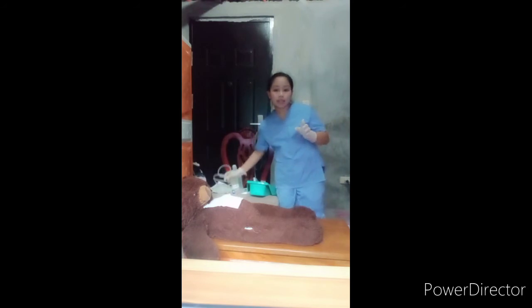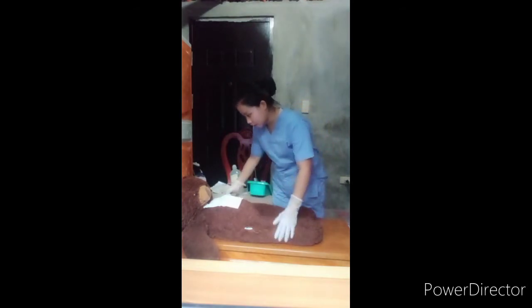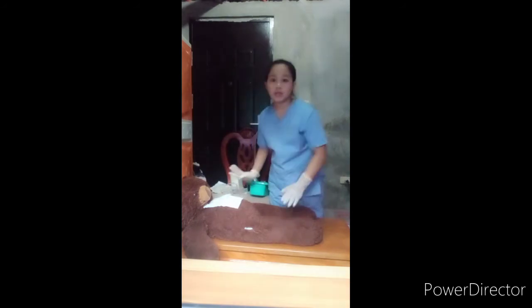And next is let's assess and repeat the procedure, not performing more than 2 passes with the catheter, and allow the patient to rest for 1 minute and ask the patient to deep breathe and cough. So ma'am, can you breathe deep and cough? Okay. And then next is let's perform artificial airway suctioning.